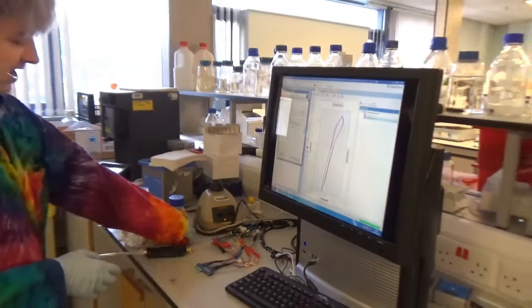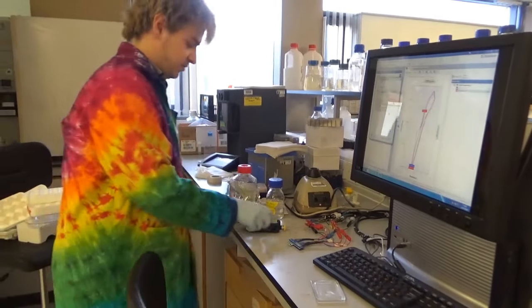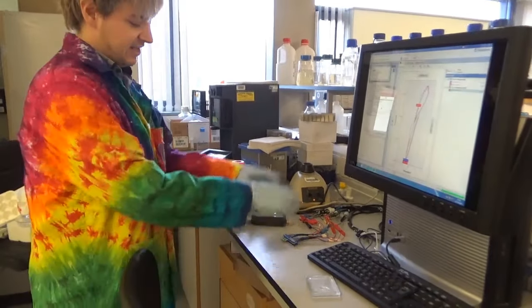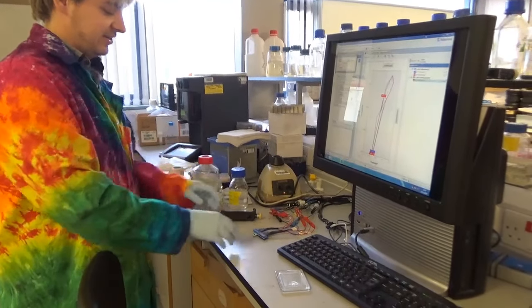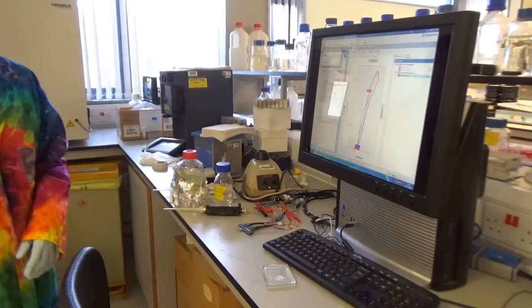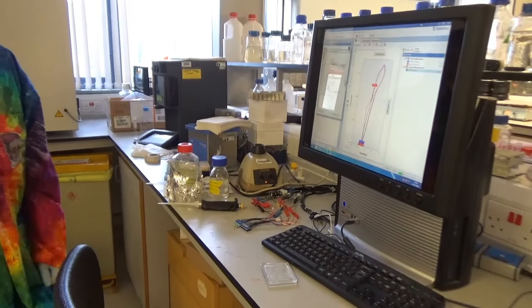What I just did there would be what you do in the doctor's office, if you like. Ideally they dunk that into a solution of this stuff. I'm just doing it quickly, but you plug it in, dunk it in, press go, and then the readout will automatically tell you whether or not you've got kidney disease and that sort of thing.